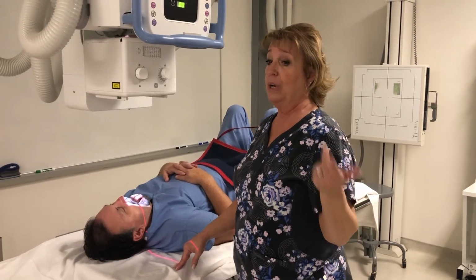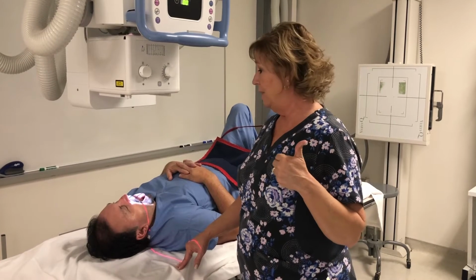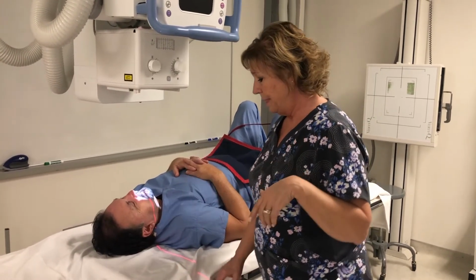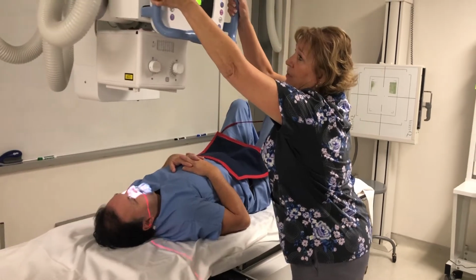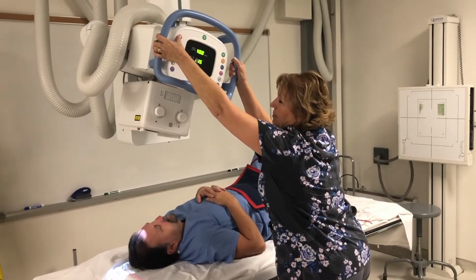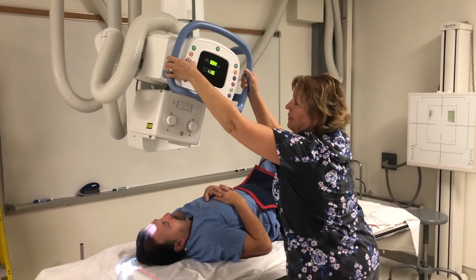That's what they call it. We're going to review this again when we talk about trauma spine work, but for now, that's how you do the odontoid. And then moving on to the AP cervical. This is a 15-degree cephalic angulation, 10 to 15. So I'm going to drop to 37.